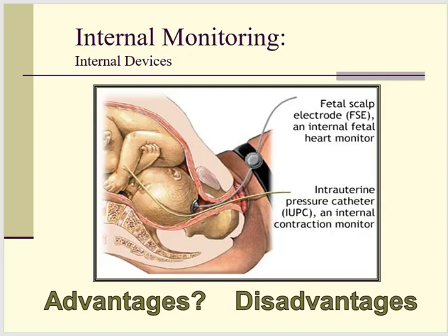There is also a way to use internal monitors to give you similar information. If you need to pick up a fetal heart rate, your baby is moving quite a bit, there's a lot of maternal tissue between the ultrasound monitor and the fetus. We like to call it fluffy in OB terms. If you have twins, there are many things that make it difficult to continuously trace that fetal heart rate. So we may need to use an internal monitor to do this.